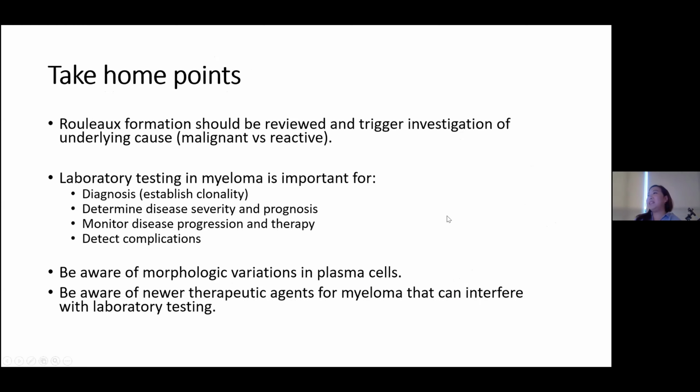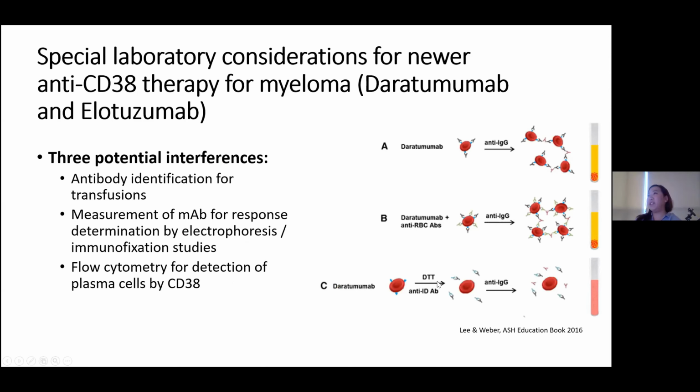So there are some techniques that people use to resolve this, for example, using DTT, but it can also denature your Kell antigens. So basically the number one solution for this is you have to phenotype your red cells before you start this treatment.